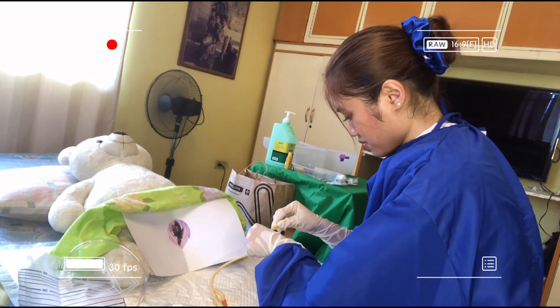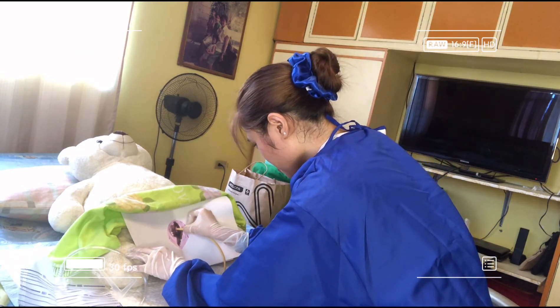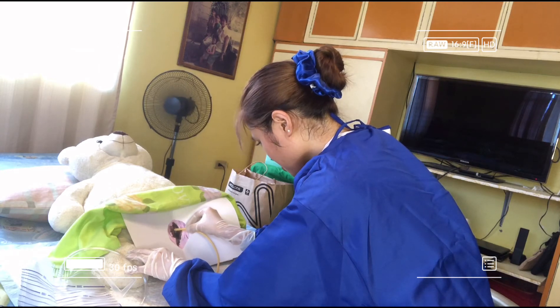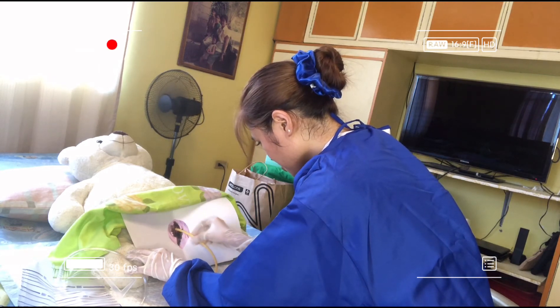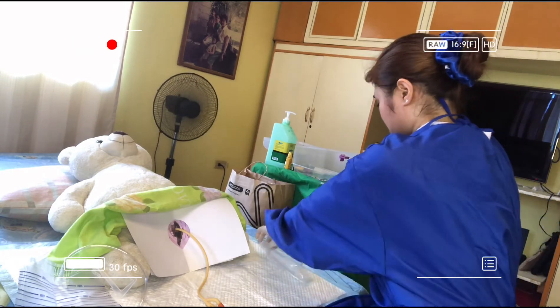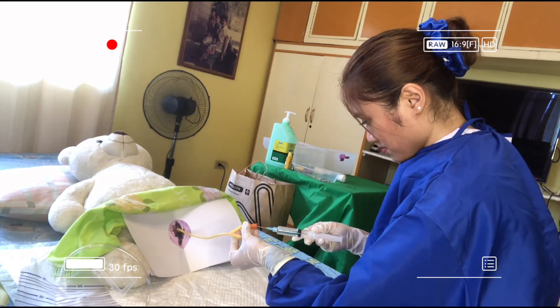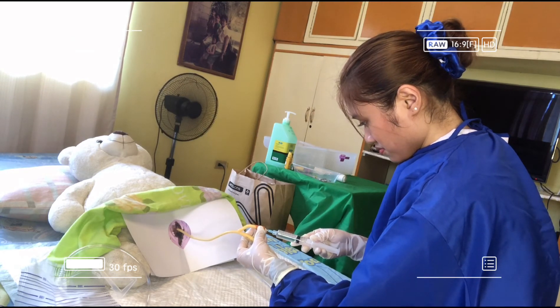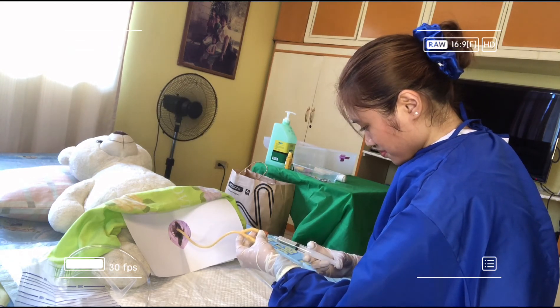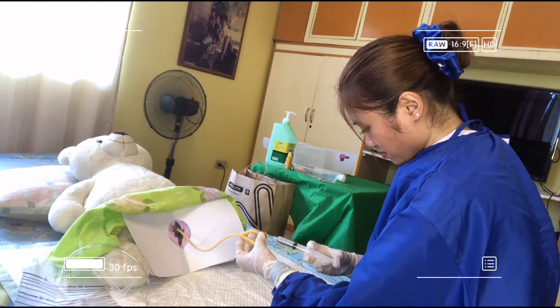Ma'am, I will now insert the catheter. Holding the catheter in the dominant hand, steadily insert the catheter into the meatus until urine is noted in the drainage bag or tubing. If the catheter will be retained with the retention balloon, continue inserting another 1 to 3 inches. Reattach the water-filled syringe to the inflation port and inflate the retention balloon using the manufacturer's recommendation or according to the physician's order. Instruct the patient to immediately report discomfort or pressure during balloon inflation. If pain occurs, discontinue the procedure.